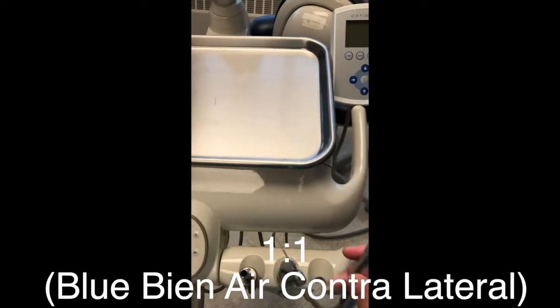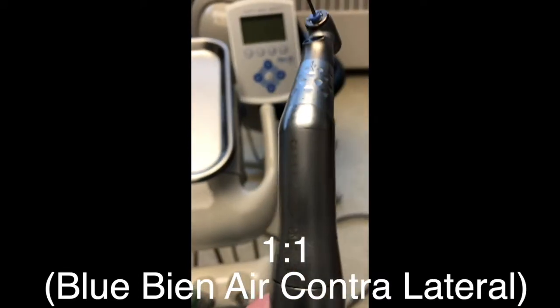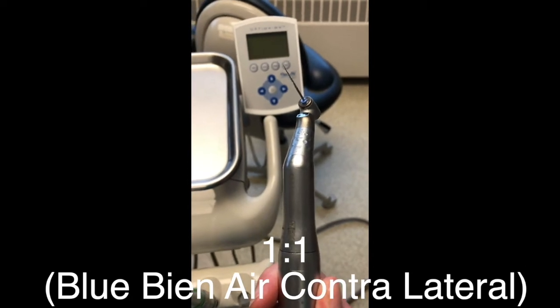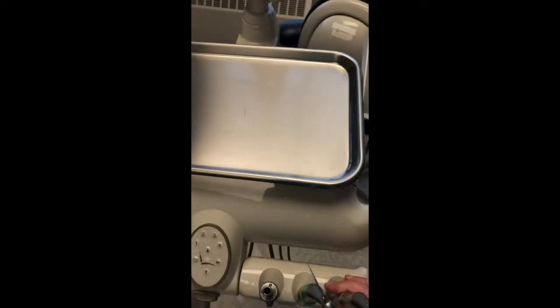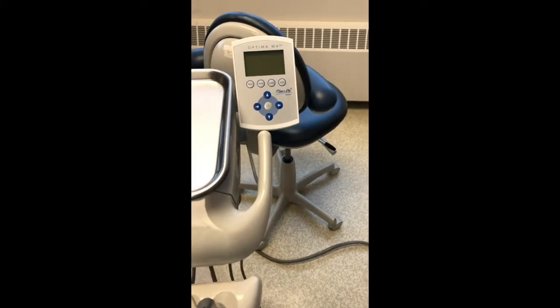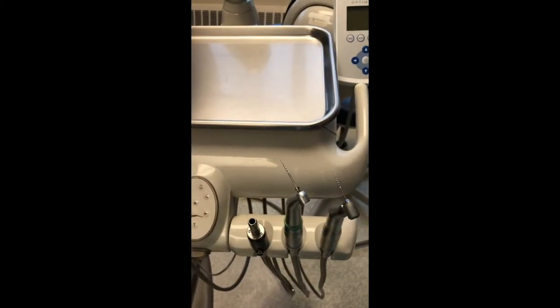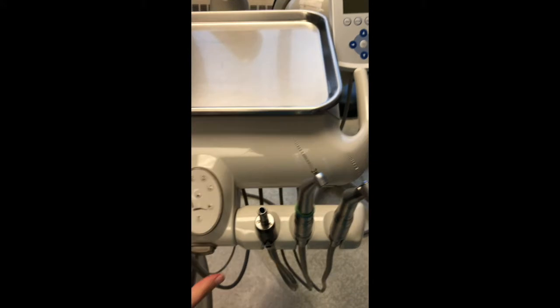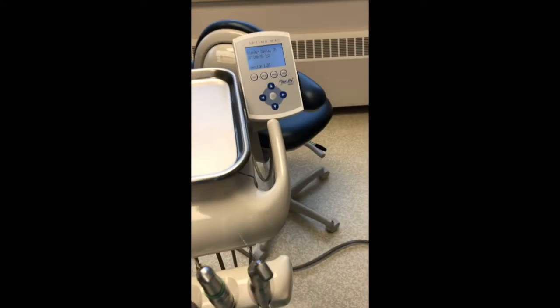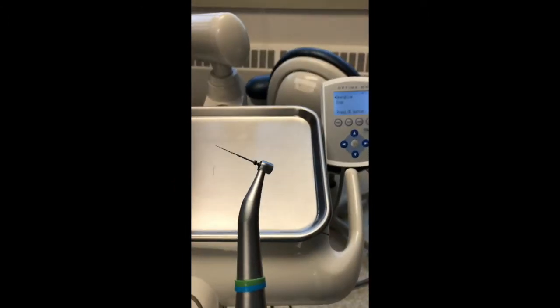And then this is a 1-to-1 latch handpiece. Both have Pro Taper Next rotary files. You have to set your control panel to allow you to use the specific handpiece that you have. First thing you're going to do is turn on the chair. Then I'm going to pick up this handpiece — this is the 8-to-1 — and you can see it automatically brings up operative or endo, so we're going to select endo.